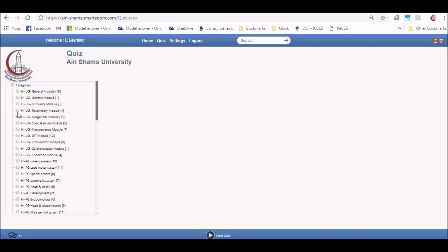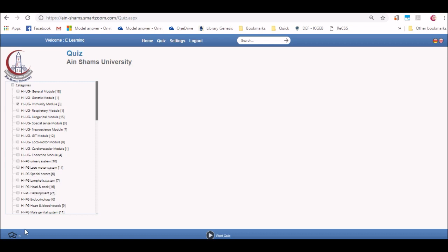When you click on quiz, a list of all available categories will appear. Click on one or multiple categories that you want to test yourself in. In the bottom left, you will find the total number of slides that you are about to take a quiz on. In the bottom center, you will click on start quiz.